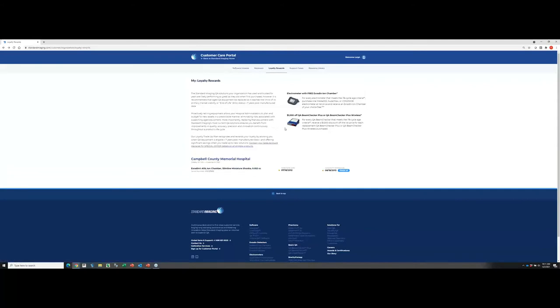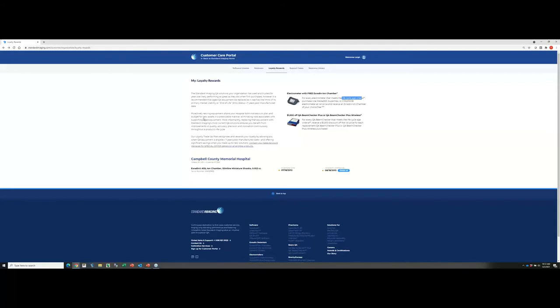In addition, on the loyalty rewards page, you can see current promotions that we might have. For example, if you have an electrometer that meets the life cycle age criteria. If you read the details here, it's basically any hardware equipment that is at least seven years or older, you would qualify for the life cycle age criteria. And you can certainly upgrade your hardware then. In this case, you can purchase an electrometer and get a free Exradin ion chamber, which is a great deal.